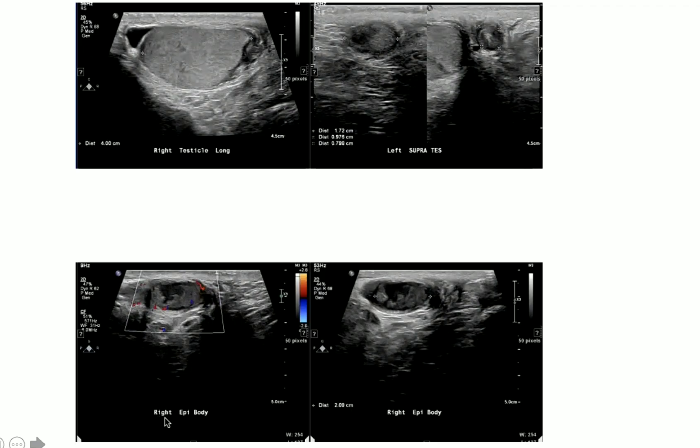There is minimal right-sided hydrocele, no definite varicocele. There is some scrotal edema, but in the rest of the images I do not see any other abnormality.